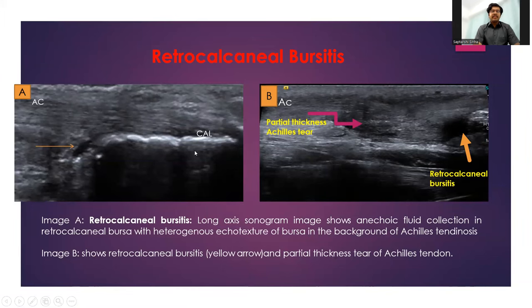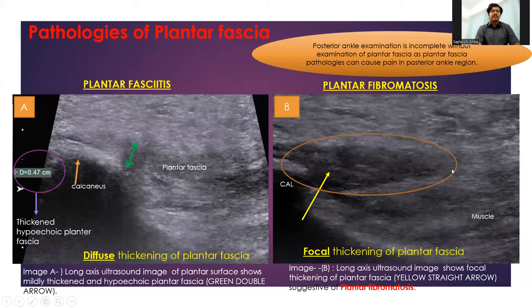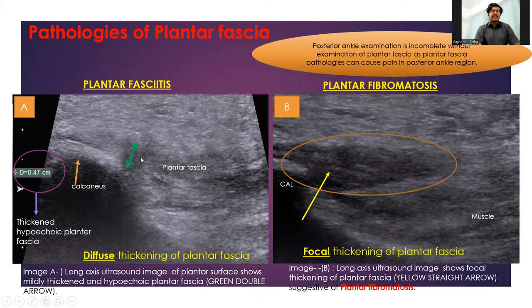Both images A and B show retrocalcaneal bursitis. Here is a case of left plantar neurofibromatosis along with the clinical image. Bilateral Achilles tendon xanthomas are demonstrated in the images. Coming to pathologies of the plantar fascia — posterior ankle examination is incomplete without examination of the plantar fascia, as plantar fascia pathologies can cause pain in the posterior ankle region. Image A demonstrates diffuse thickening of the plantar fascia indicating plantar fasciitis, and here is a focal thickening showing plantar fibromatosis.